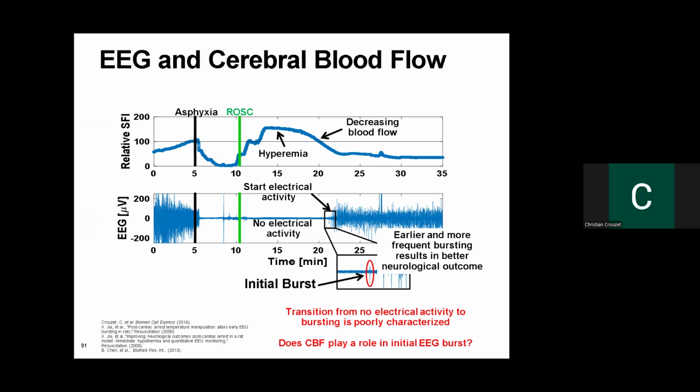Yeah, so that's where you do need to consider optical power and everything, because you do need enough signal for your data to actually be able to look at these flow dynamics that are occurring. And for those where you do have a large field of view, I definitely look at eye safety calculations because I want to maximize the light that I send onto my sample, but still be able to be eye safe for people, especially if eye protection is not being used for those applications.